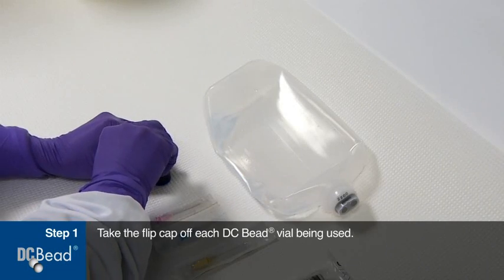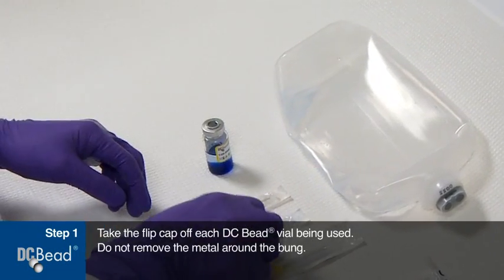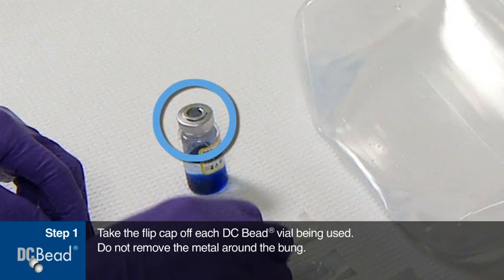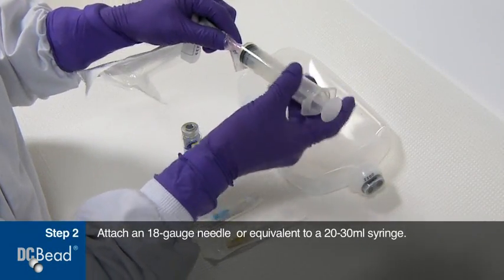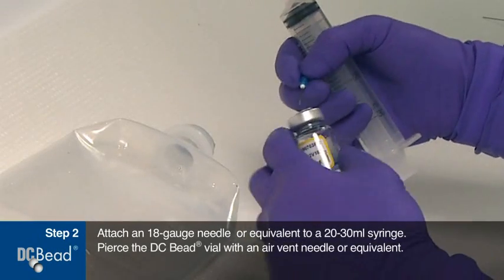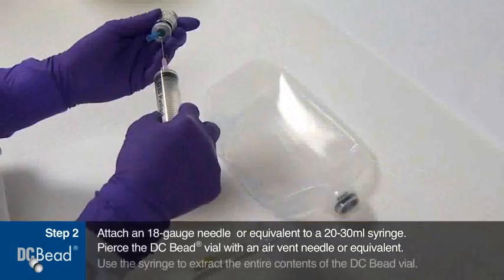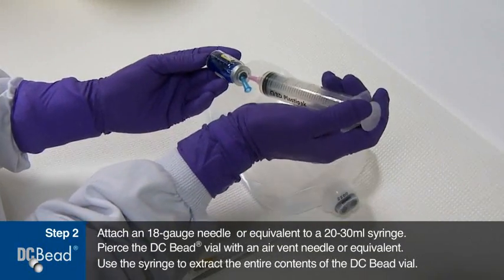Take the flip cap off each of the DC bead vials being used, but do not remove the metal around the bung. Attach an 18 gauge needle or equivalent to a 20 to 30 milliliter syringe. Pierce the DC bead vial with an air vent needle or equivalent. Use the syringe to extract the entire contents of the DC bead vial.